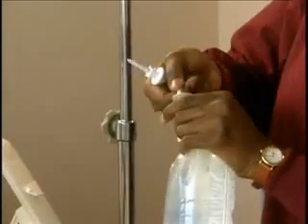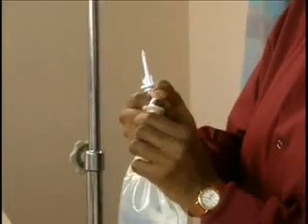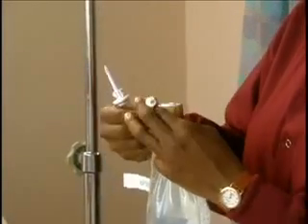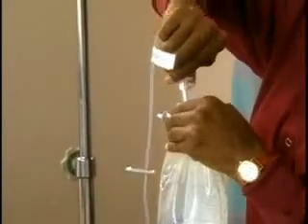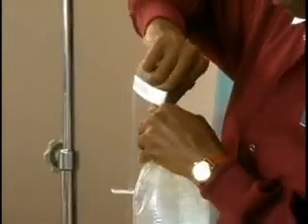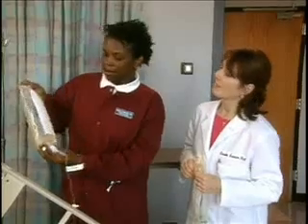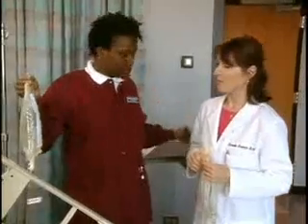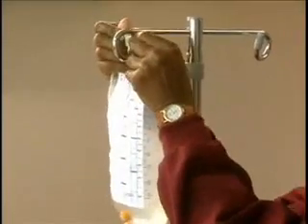Okay, I carefully remove the protective cover seal at the entry port. Careful not to touch that too. Now just be very careful. Insert that with a firm push and kind of twisting motion. There you go. Careful not to touch again, of course. Okay. Good job. Okay, now I hang the new IV solution bag on the IV pole.